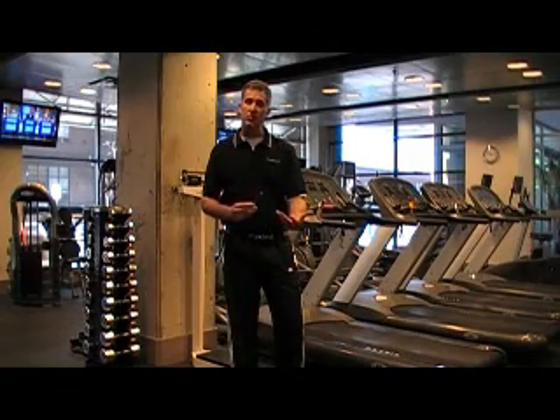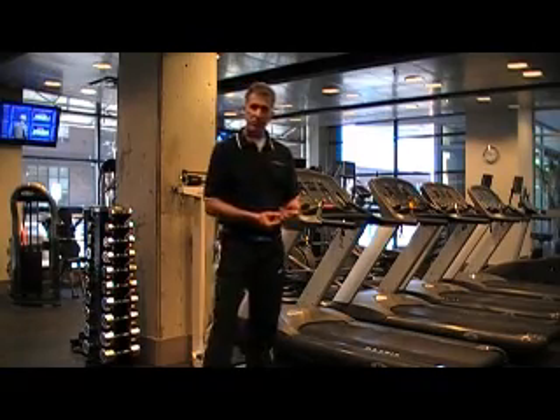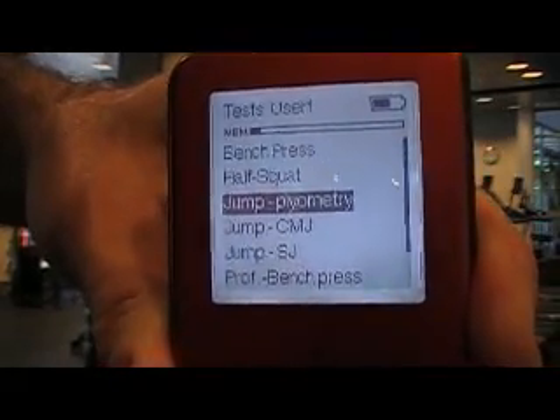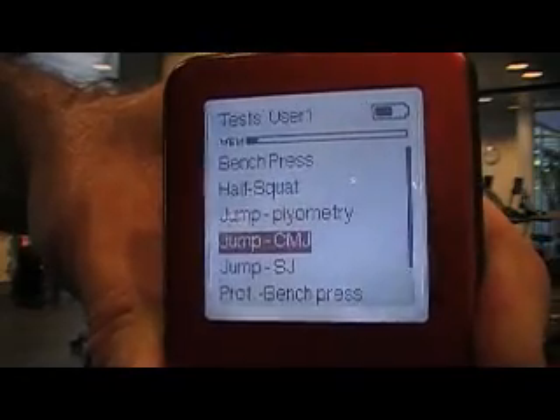Let me first give you a quick demonstration of how the MyoTest gathers the information, then we'll talk about what this information means and how you can use it as a coach. I have my MyoTest device turned on and I'll hit enter to go into one of the protocols. Let's first start with jump counter movement, also the same as vertical jump.